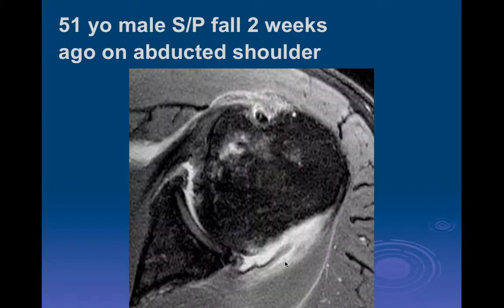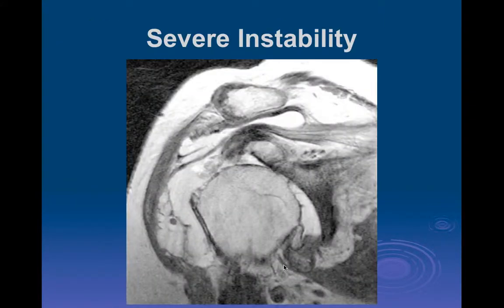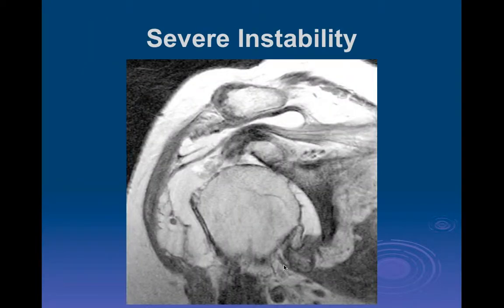You can see the capsular tear. Oh, wow. He's really torn his capsule. Oh, my God. Yeah. So he had a dislocation and tore the posterior capsule and then had an impaction of the front. And then severe instability. This is just one who has severe dysplasia and secondary degenerative disease with chronic longstanding instability and tearing. Let's look at that prior one, too.